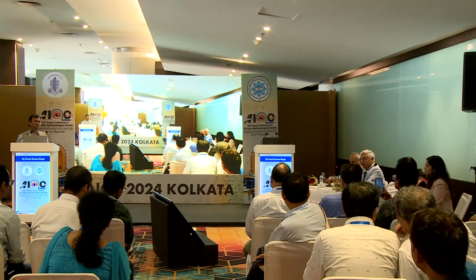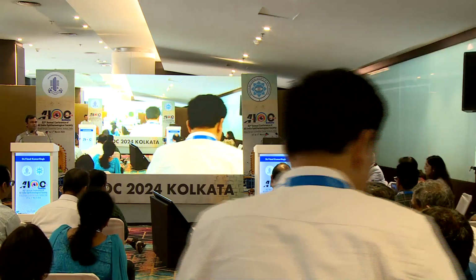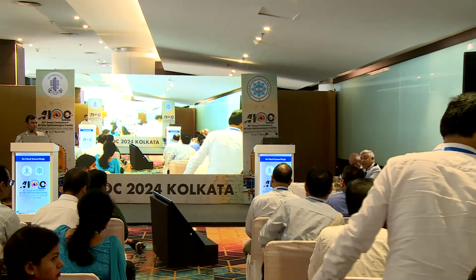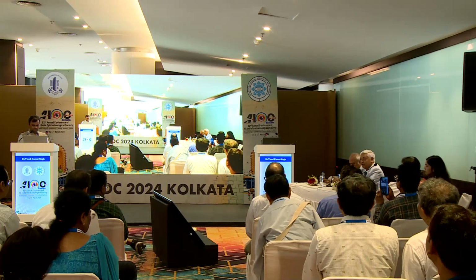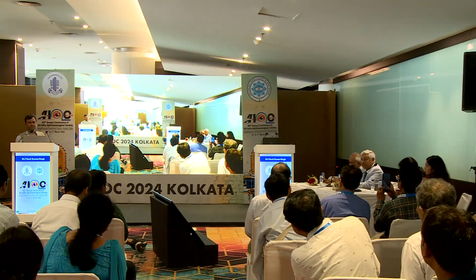And then the next morning and the evening, the patient will get the vision. So you have this in such cases that in the same sitting, in spite of so much complication, the patient definitely will get the vision. So as a primary procedure, this retropupillary is definitely a better option, one of the best options.